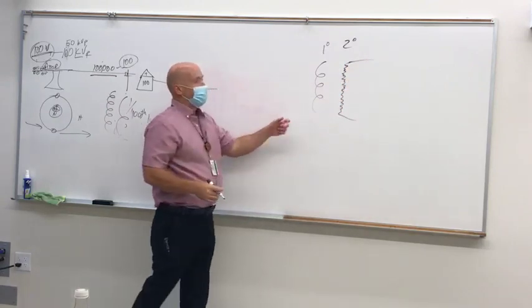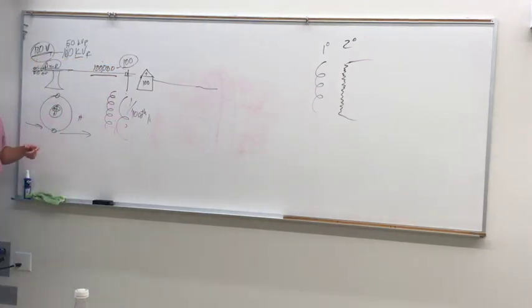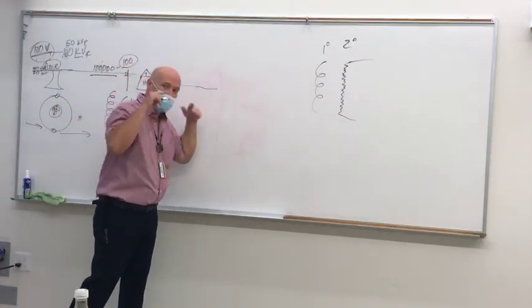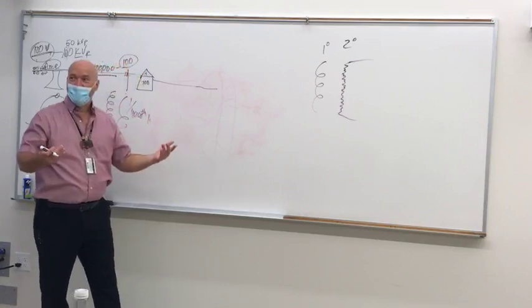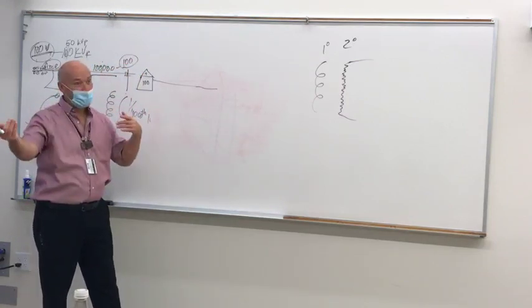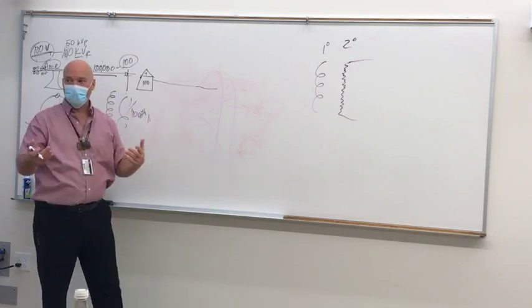What do I need to supply to this to make it work? Amperage, which is current. But not only do I have to have current, I have to have electrons, which is current, right? It goes back and forth. Not reciprocity in this case, but electricity, alternating current.